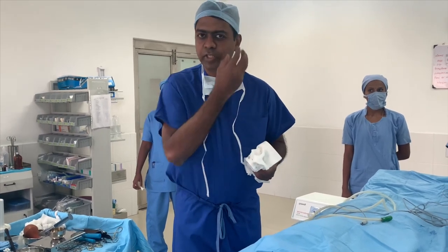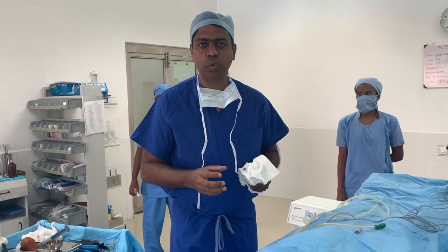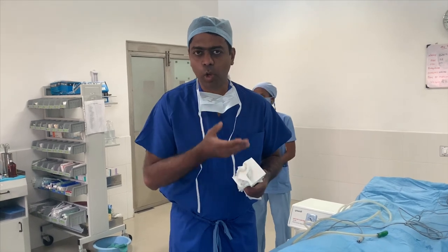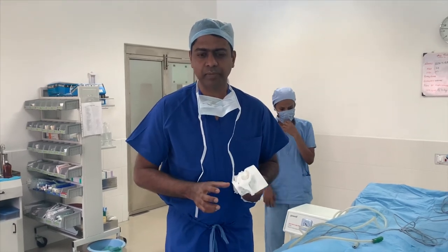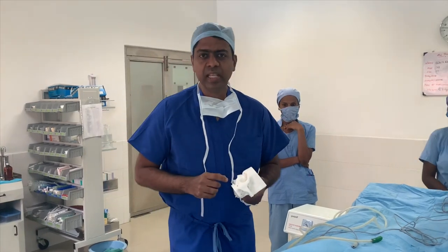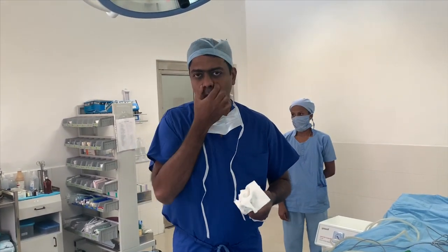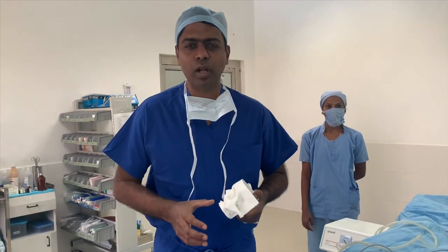This patient sustained a road traffic accident a few months ago, because of which his orbital symmetry has been changed. He has a slight orbital dystopia and minimal enophthalmos on the left side. I'm going to reconstruct the left orbit — orbital floor reconstruction and orbital wall reconstruction with a pre-made 3D custom fabricated implant. Additionally, I'm doing a rhinoplasty because his nasal dorsum has become flat and broad. I'll narrow it, increase the vertical height, and reduce the alar width. These models have helped us design implants preoperatively, saving time and enabling precision up to a millimeter.